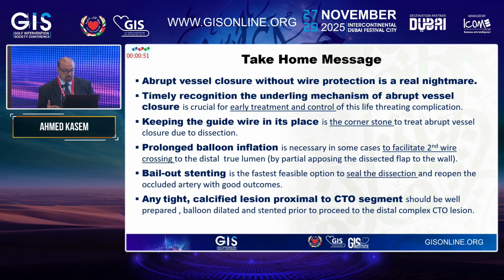And a very important statement: a calcified lesion proximal to the CTO segment should be well prepared, balloon dilated, and stented even prior to proceeding to the distal CTO segment. Thank you.